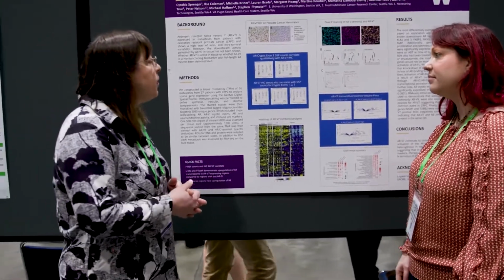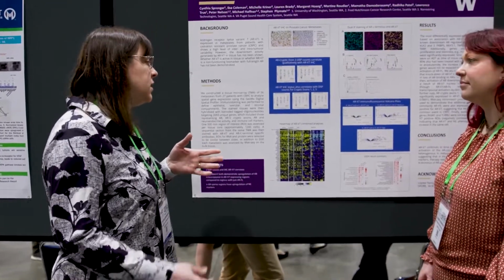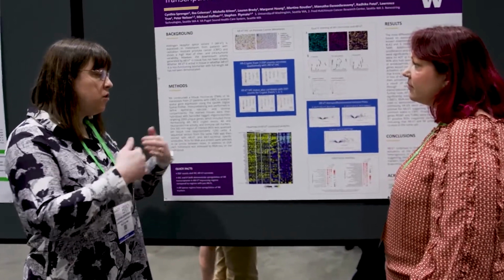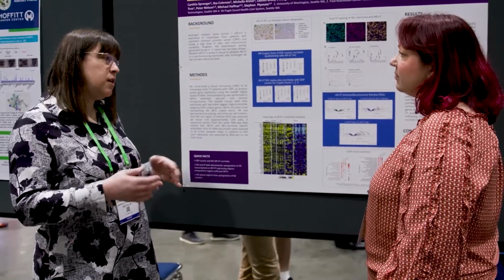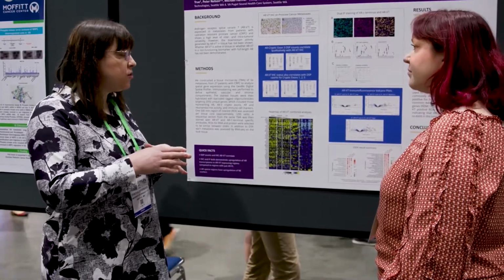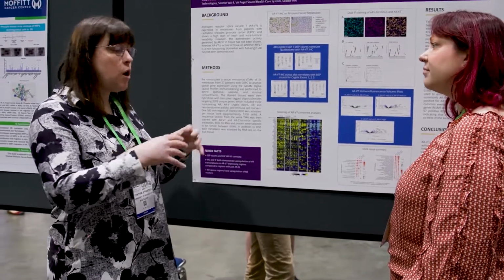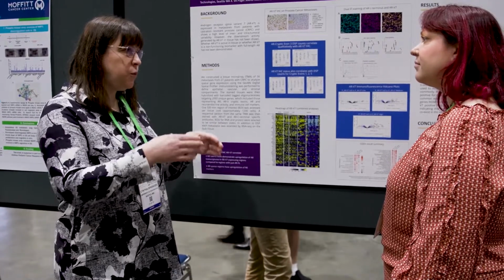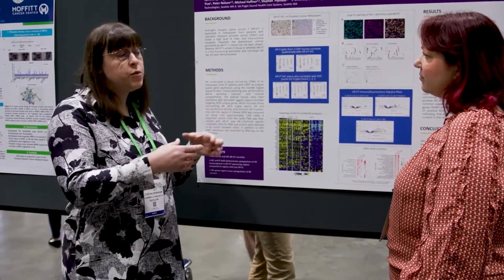Yes, so we worked with NanoString to use their digital spatial profiling, and the reason we did this is because we have a nice array of tumor samples from patients that are in stage. So these samples were collected during autopsy. We have 27 patients represented and 56 metastases across those patients. And so in prostate cancer, there's a lot of difference in what is being expressed in different tumors within a patient. So not all tumors are exactly the same. And we specifically wanted to look at those differences within tumors. And so the DSP really allowed us to do that because we could select regions of interest.